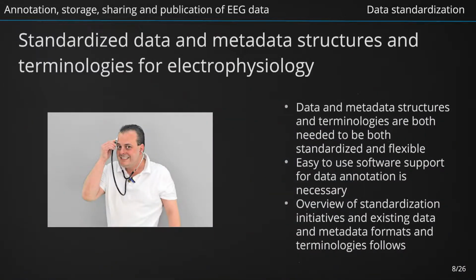The way we annotate data in our laboratory indicates some difficulties that are related to description and standardization of EEG and event-related potential data. On one hand, we need some standardized data formats, metadata structures, and terminologies to successfully and meaningfully annotate and share data in a longer term.